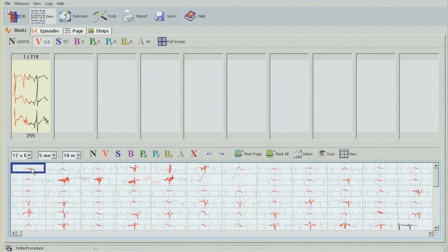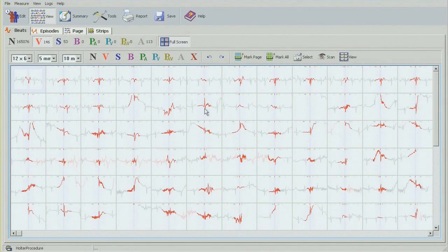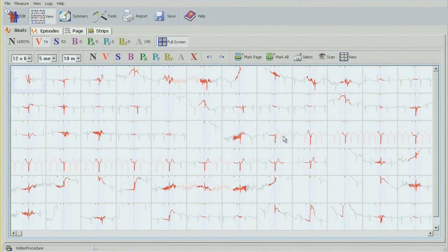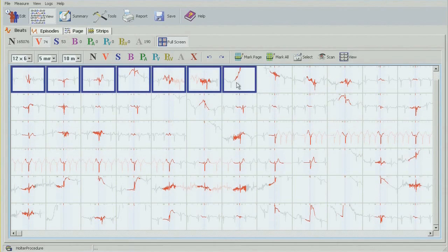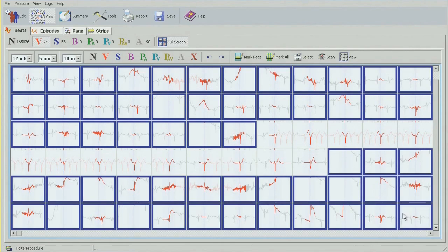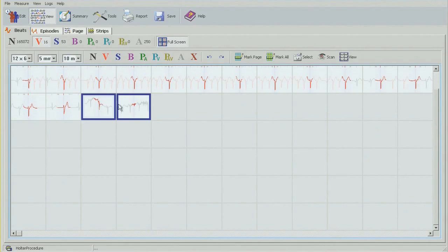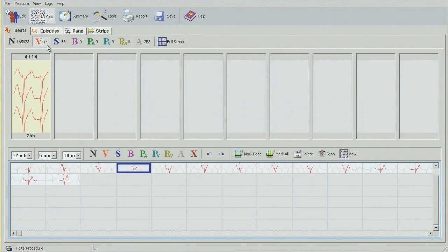Finally, the last bin — same idea with the Z button. This page is all artifact, so I'm going to change the whole page by clicking on 'mark page' and selecting artifact. This page is the same — there are some normal beats here, but I'm just going to artifact the whole page. Here we come across some actual ventricular beats, so I'll select the top two and a half rows one at a time with a single left click, or press and hold to drag. Changing those to artifact, and the last two as well. At this point I'm finished editing through ventricular beats — there are 14 of these left.